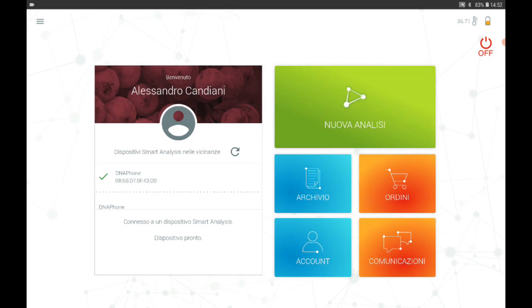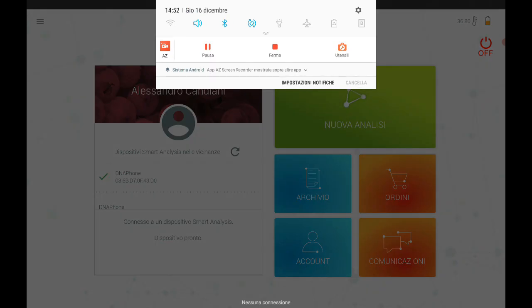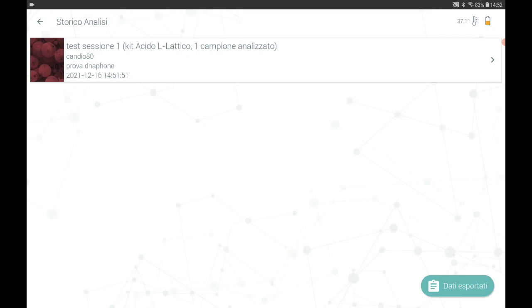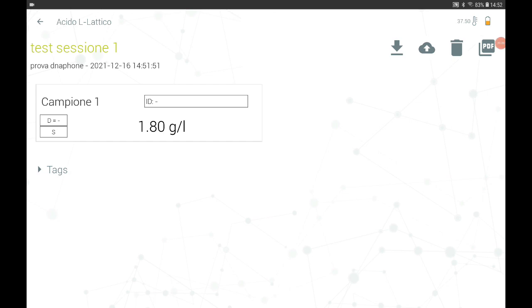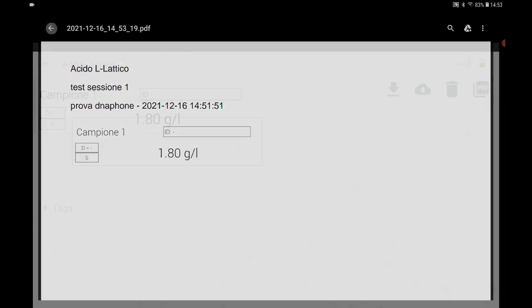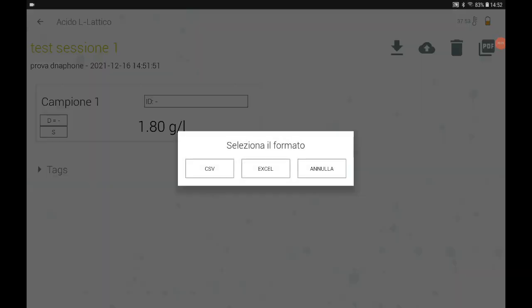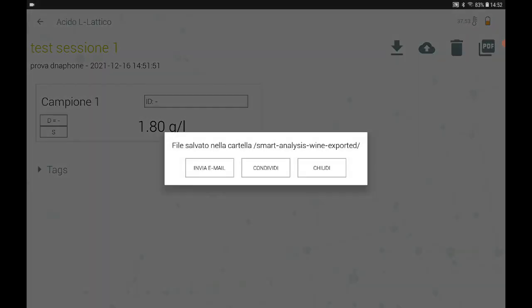Let us see how the different formats can be managed via the archive. In the archive, all results are saved automatically by the application. Start up the Wi-Fi and enter the archive section. Select the analysis session you are interested in and at the top right you will find all the options for managing the results: you can create and share a PDF directly from this session, or export the data in Excel or CSV format at your discretion. You can share it or keep it on your tablet.